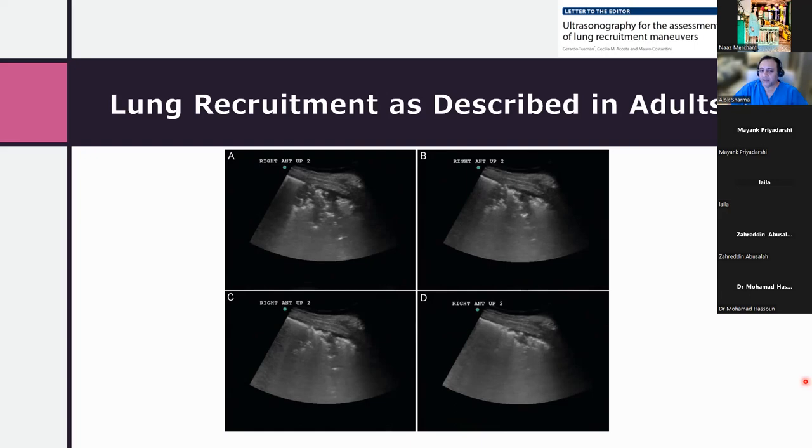Yeah, clinical experience. What I'd say is, what is the background and what PEEP did you start with? I'm giving you ventilated babies here. You can do this on non-invasive ventilation. On non-invasive ventilation, using PEEPs of up to 8 to 10 is something that I do. I'm going to be very honest, I'm not as brave as my Canadian colleagues to hit PEEPs of 12 and more.